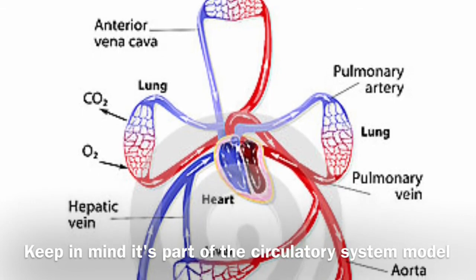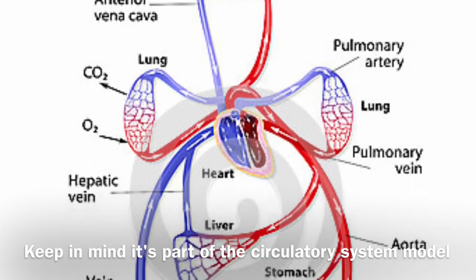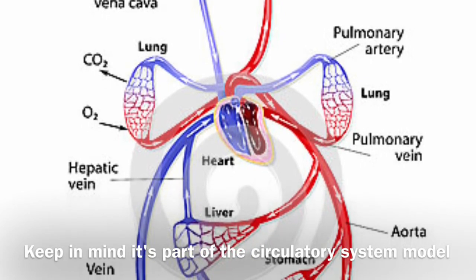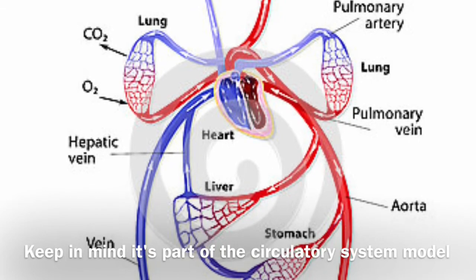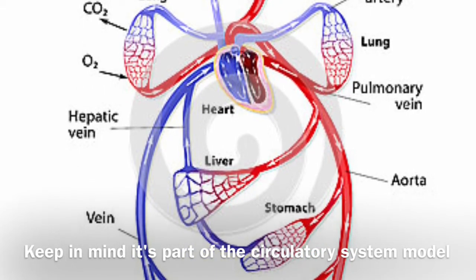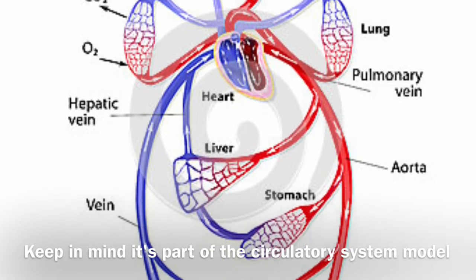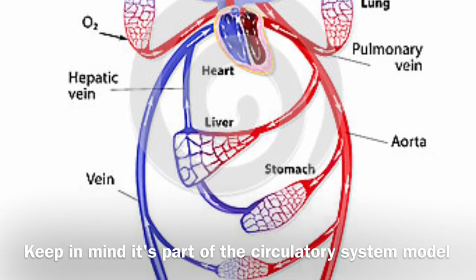Spectral analysis is simply a wave that reflects the cardiac cycle at this location. You have to bear in mind that the point you're analyzing is somewhere downstream in the circulatory system, and the changes in the wave at that point is a reflection of the heart's cycle and the proximal arteries before it or leading to it.